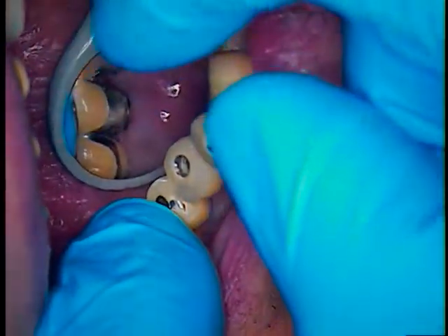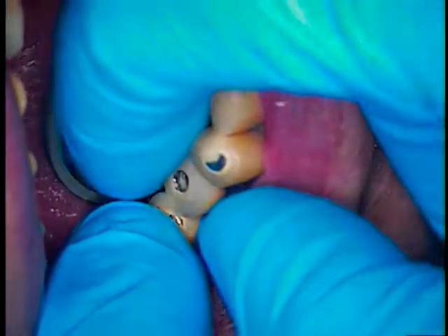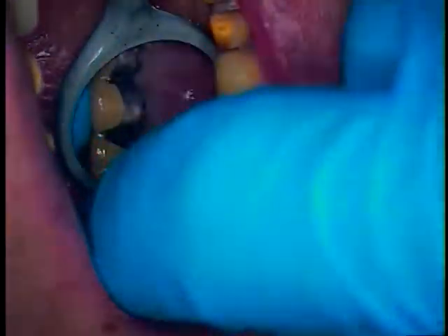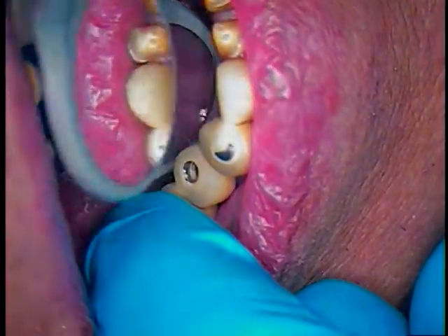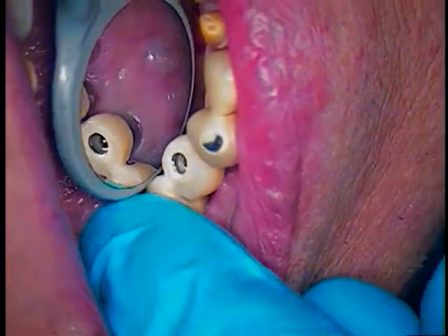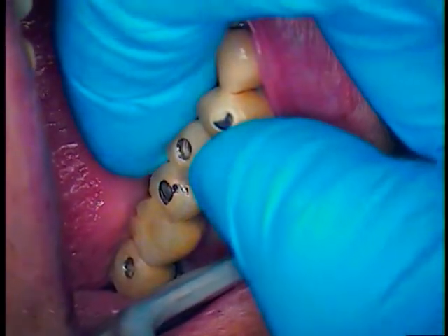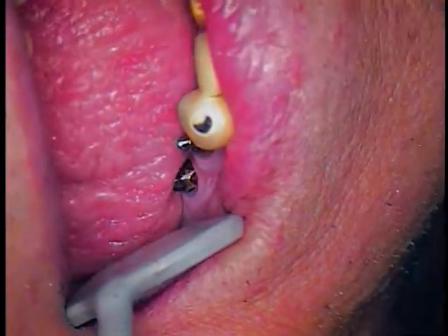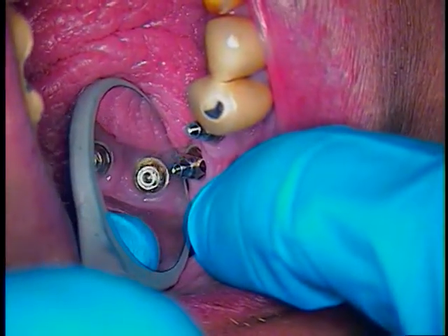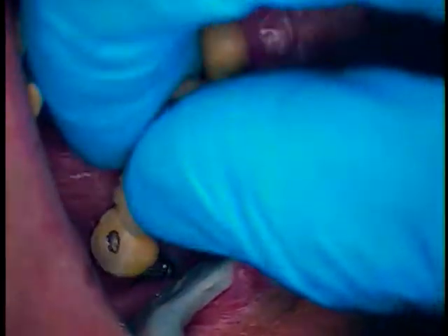Looks good. There's a slight little gap there so I'm going to look into that. That could be with tightening or could be very slight on the second bicuspid. That looks like we're pretty close. We might be on tissue — some of the tissue might have grown over, possibly preventing it from seating. But it looks like the back abutment is in the right angle.